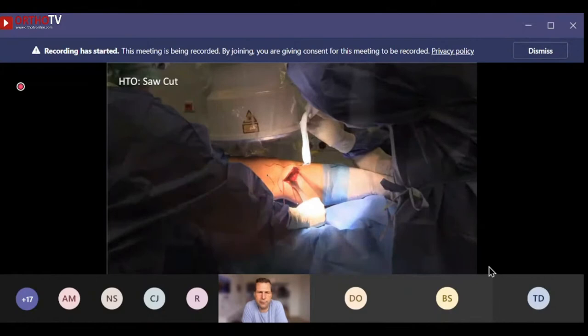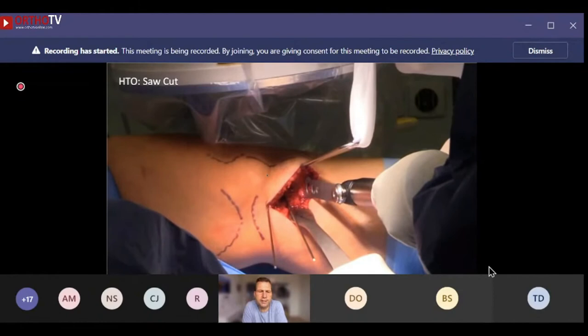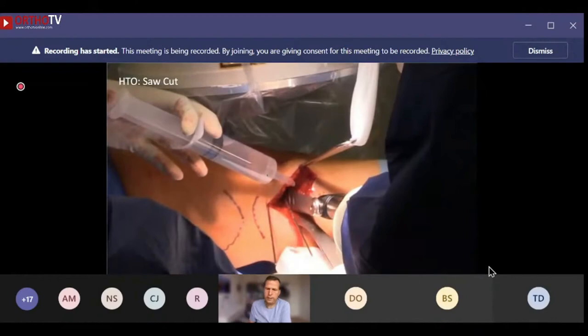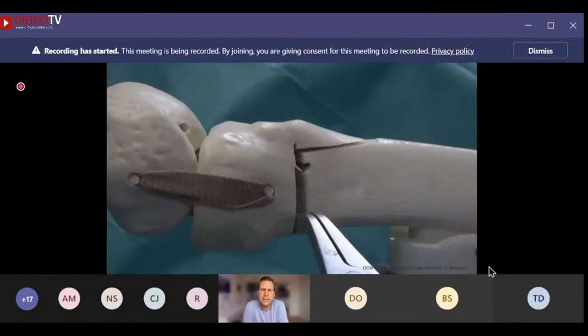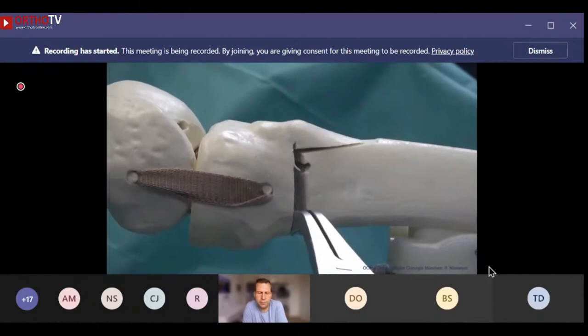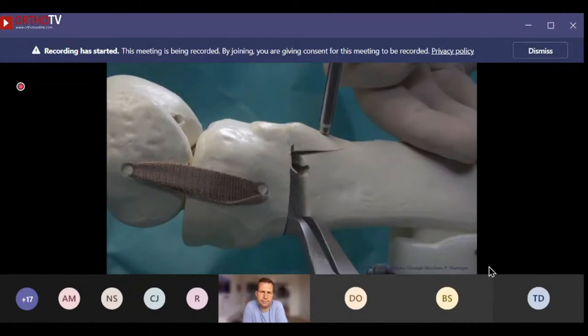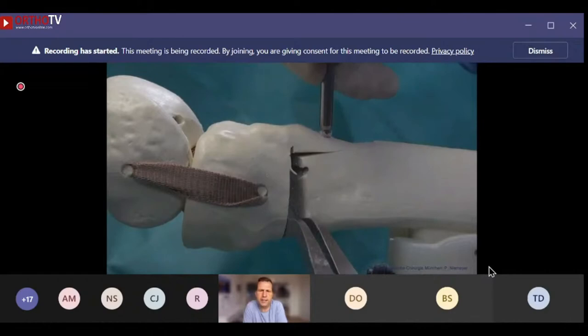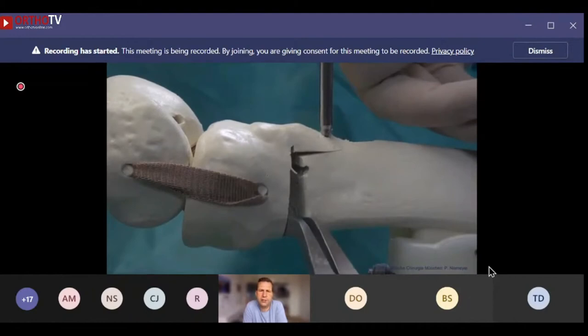The osteotomy is performed under continuous radiographic control — we set up the image intensifier parallel to the lateral plateau and orient the saw accordingly. We go for biplanar osteotomies in all our cases. The typical biplanar osteotomy includes a proximal cut, but we also perform a specific distal cut leaving the tibial tubercle on the proximal part of the osteotomy in order to reduce or at least not increase patellofemoral pressure.